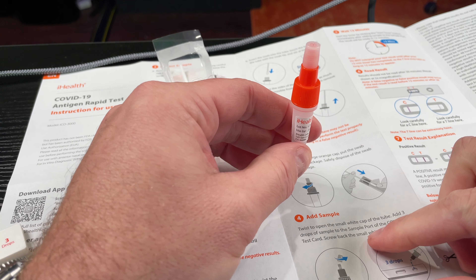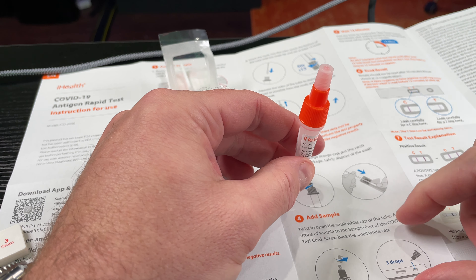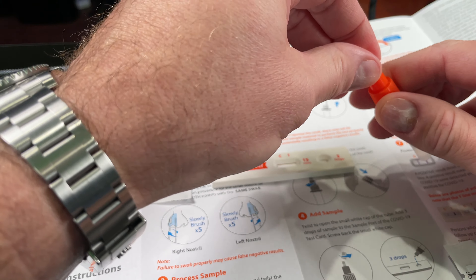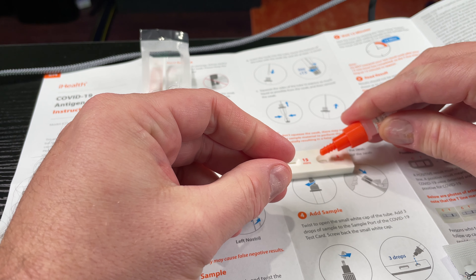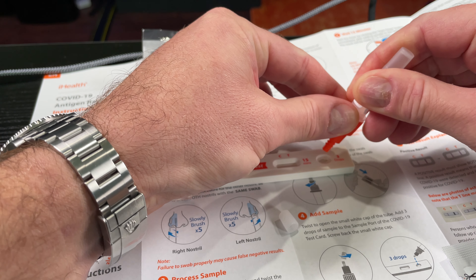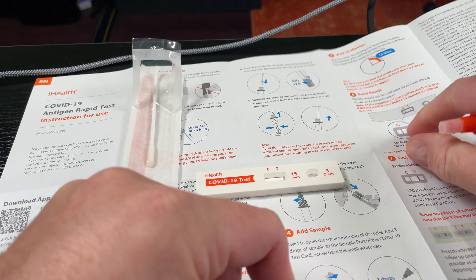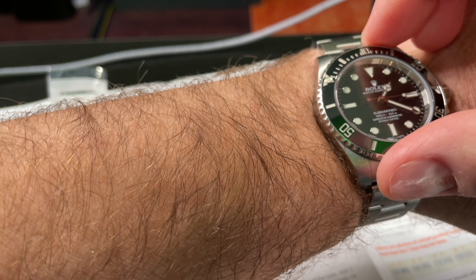Now it says twist open the small white cap of the tube and add three drops of sample to the sample port of the COVID-19 test card. I'm going to unscrew this and add three drops — one, two, three. That's got three. Screw the small white cap on. Now we wait 15 minutes. I'm going to set my timer for 15 minutes.